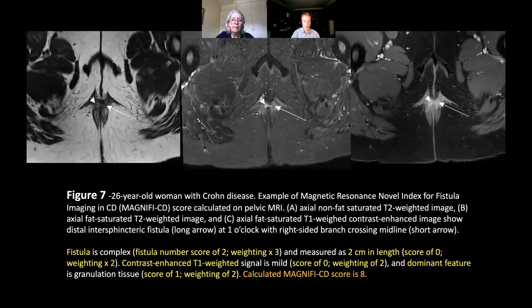Finally, we look at the T2 signal of the fistula, again compared to the adjacent vessels, and this is a little bit increased, so this got a score of two as well. When you add up all these various factors, this patient had a MAGNIFI-CD score of eight. In the paper we'll go through other scores as well, explaining how we calculate these and how we can use them.